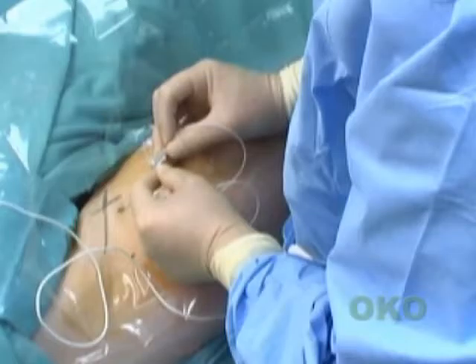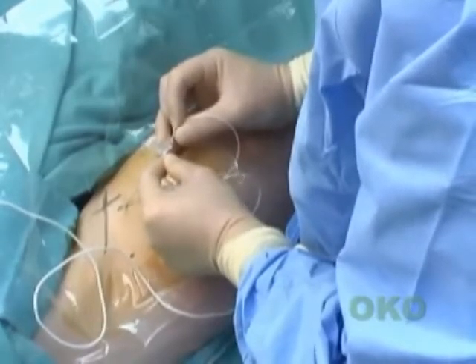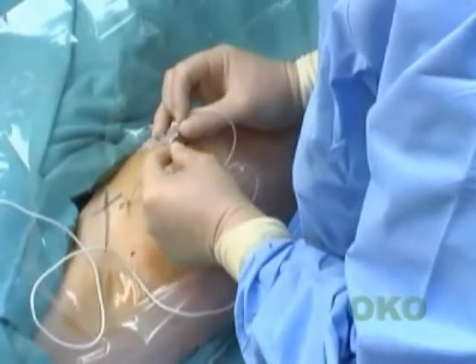If required, the catheter can be advanced until adduction of the thigh due to obturator nerve stimulation is observed, but this maneuver is usually not necessary since the spread of local anesthetic agent will be cephalad along the femoral nerve if the catheter is properly placed. Remove the needle without disturbing the catheter.